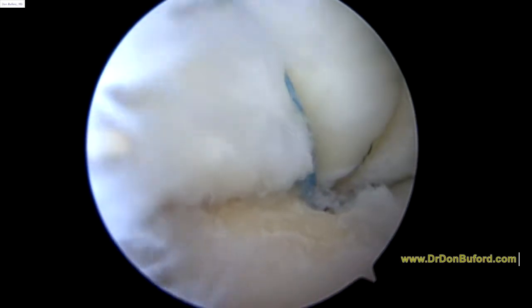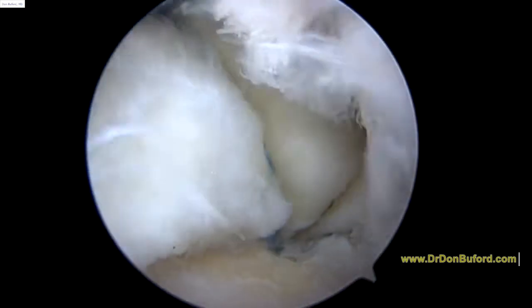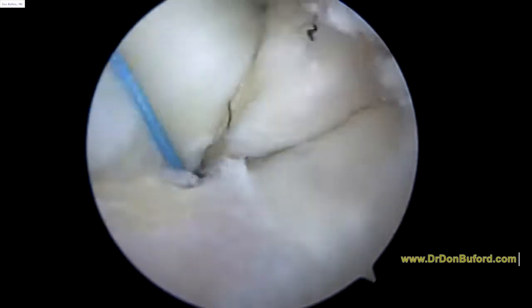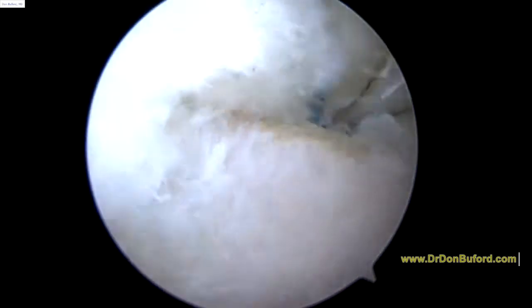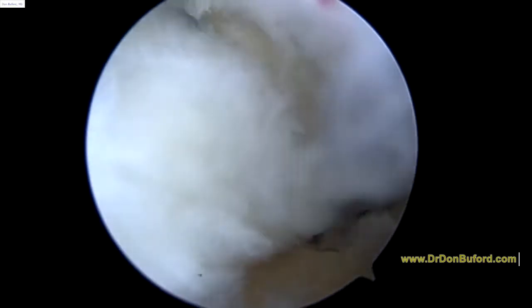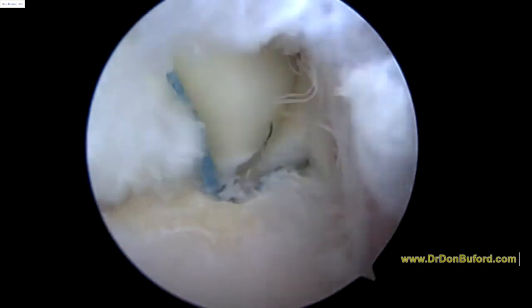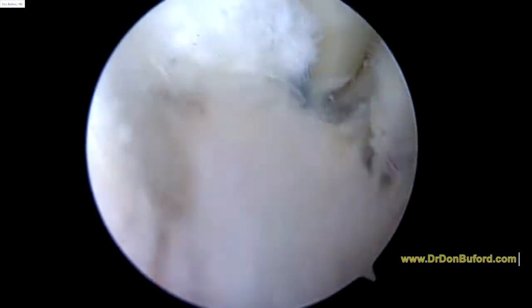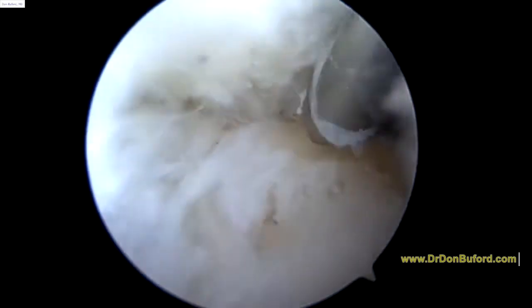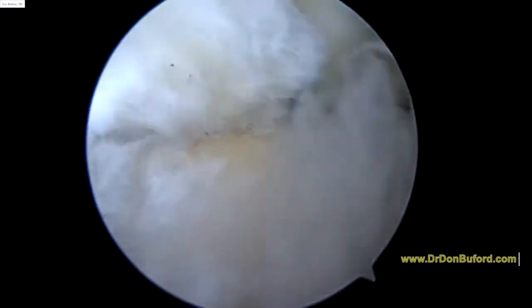I'm going to make a little hole in the bone with a little 2mm punch to release some of the marrow elements and hopefully stimulate even more of a healing response. But that's that far lateral. Sometimes these far lateral tears are difficult to access because they're way around the edge of the insertion. But as you can see, we've got it repaired. I'm going to take a punch here and a mallet. I can just see the punch here. We obviously don't want to affect our anchor, so we're going to punch way lateral.